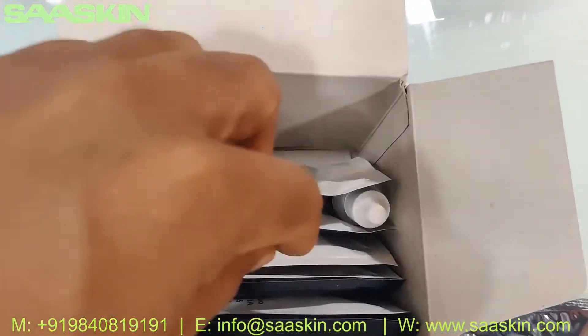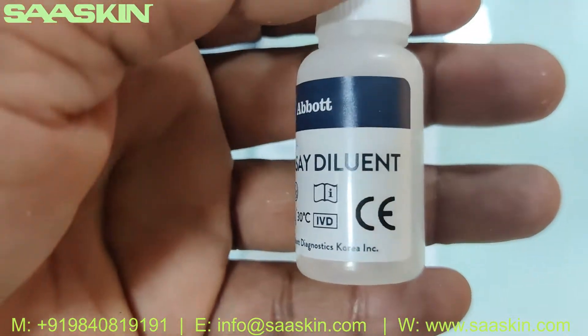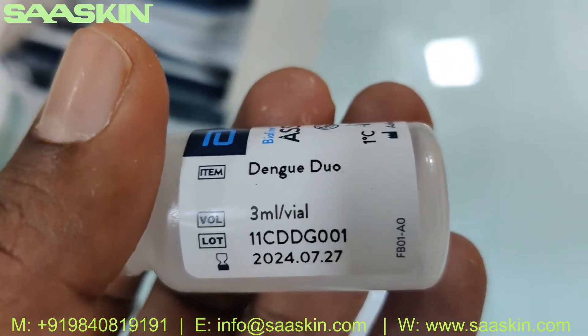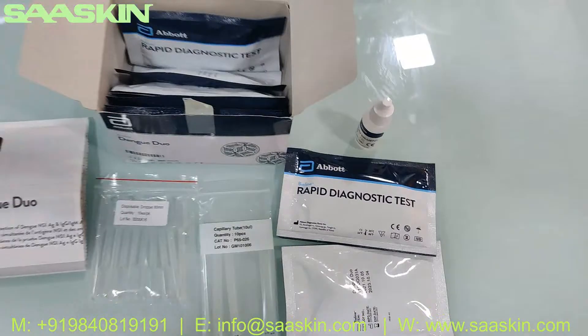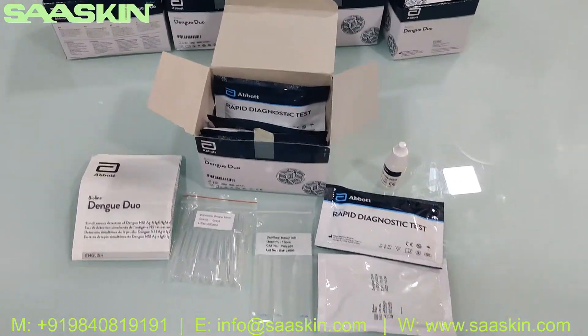Inside you can also see a dilution buffer. This is a 3ml buffer liquid. So this is what the kit looks like.